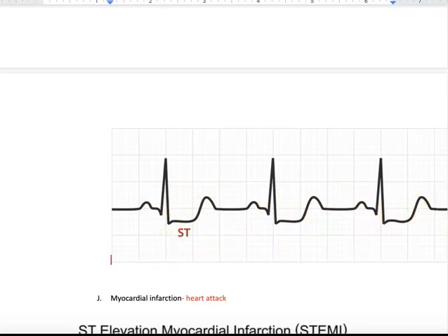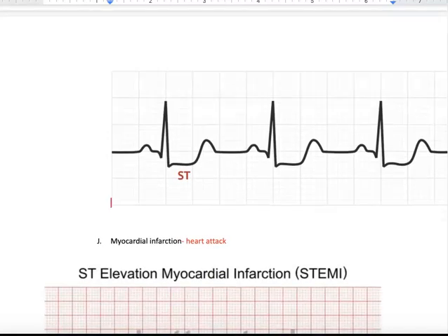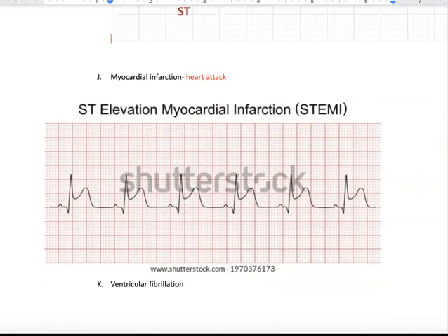Now, some people may have ST segment depression with no heart issues, which would be a false positive. Some people might not have ST segment depression and still have a blockage. But again, the advantage of it is it's not invasive. Okay? One more thing.